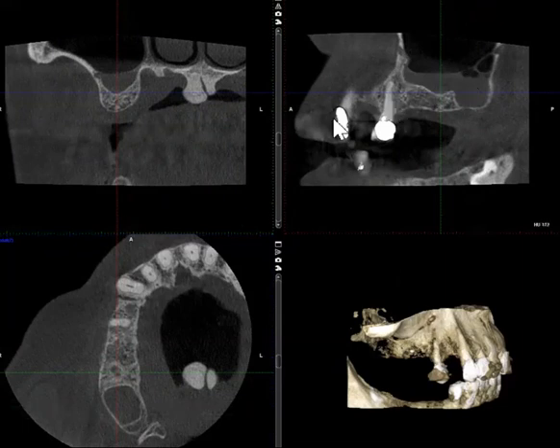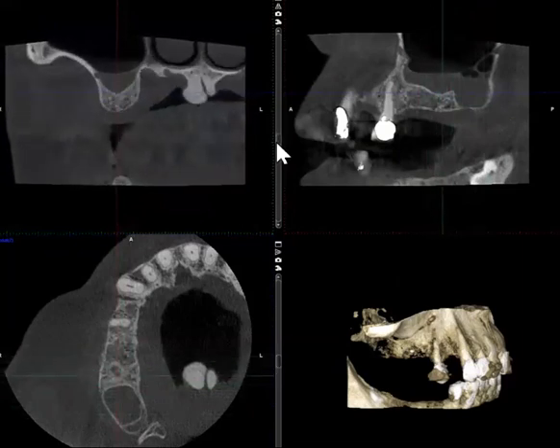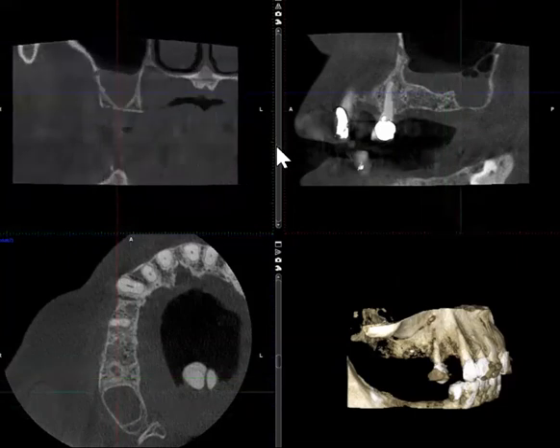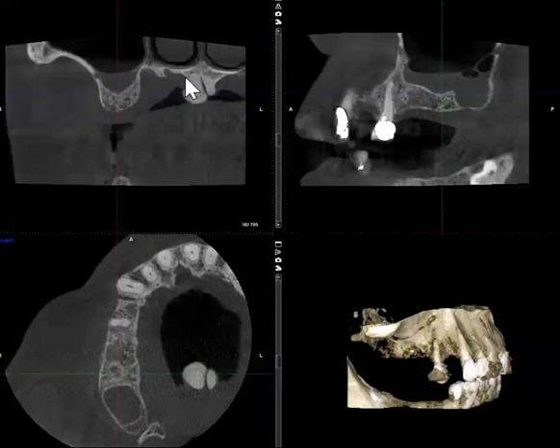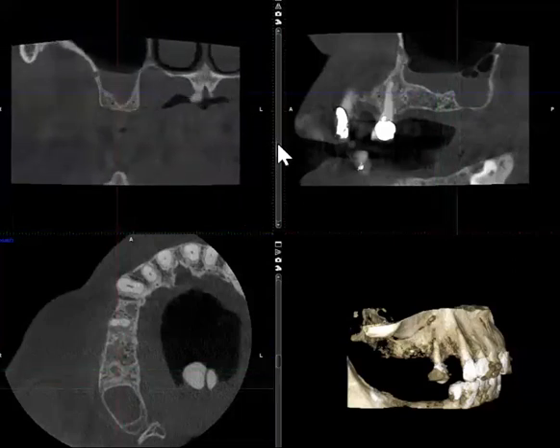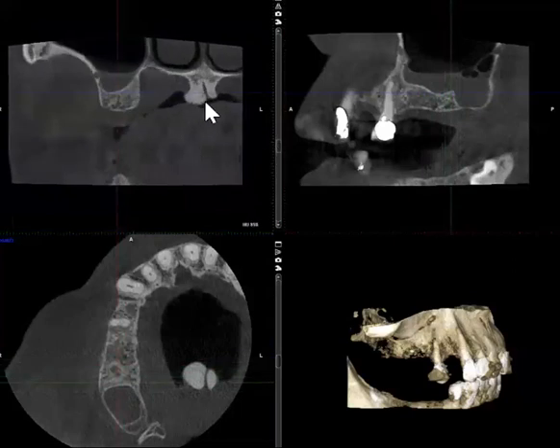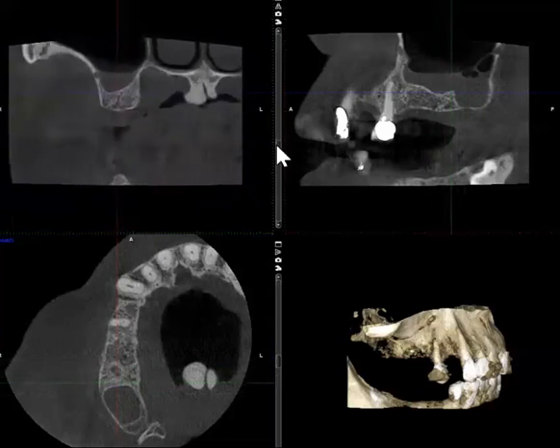Another interesting feature visible from this coronal view is that the maxillary torus has grown in an asymmetric fashion, so that the right side is larger than the left side. We do see that from time to time, and there is that asymmetric appearance of the maxillary torus.